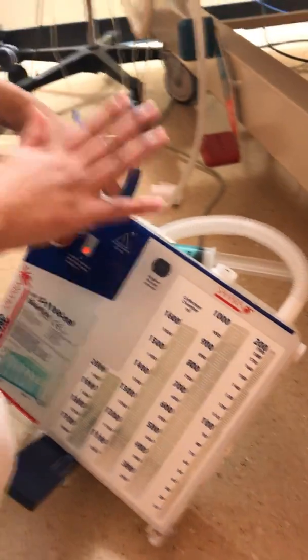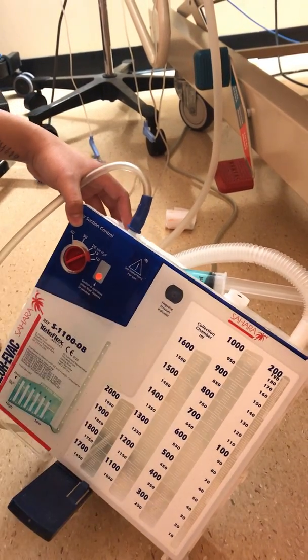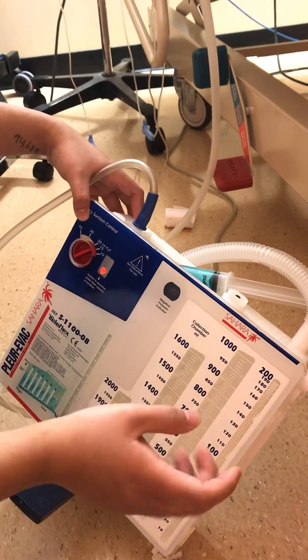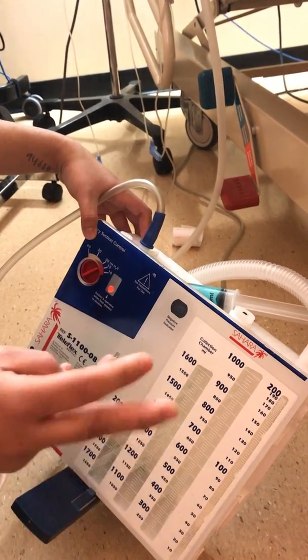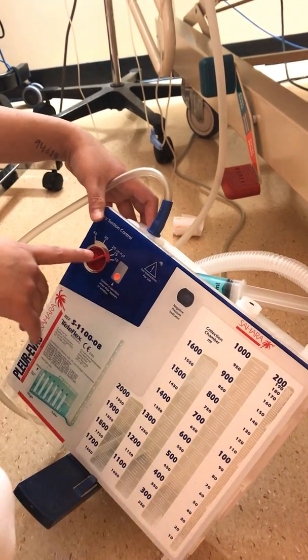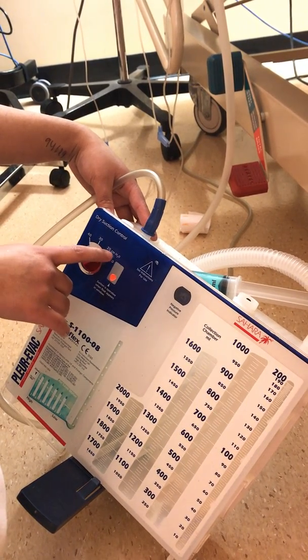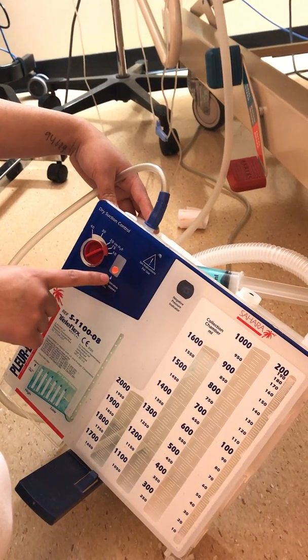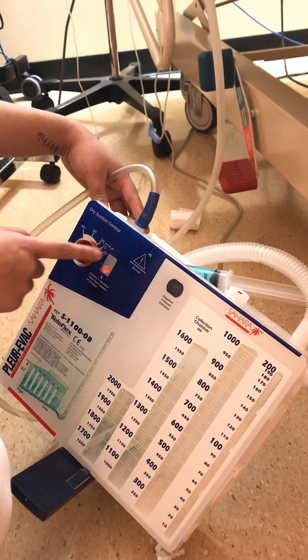I'm going to make sure that the drainage system is below my patient, which it is. At the beginning of my shift, I'm going to take a piece of paper and mark where the drainage is. I'm going to mark the amount, the color, any odor, and consistency of the drainage. Right over here we have the dry suction control. We need to set this at 20 centimeters of water, which is prescribed by the doctor. This whole thing is working as indicated by this orange ball, which is visible.